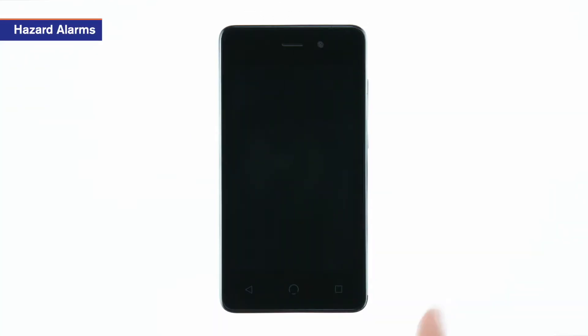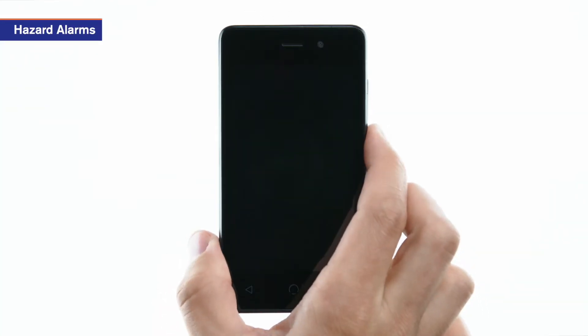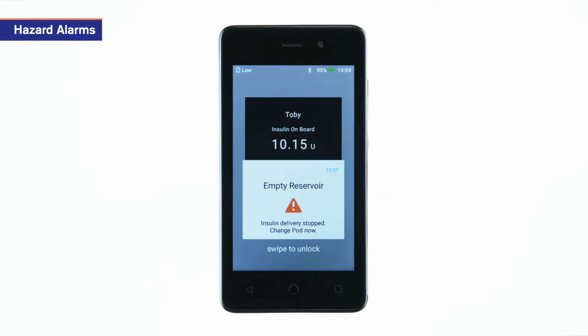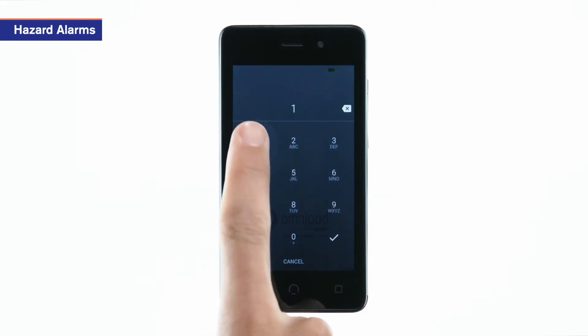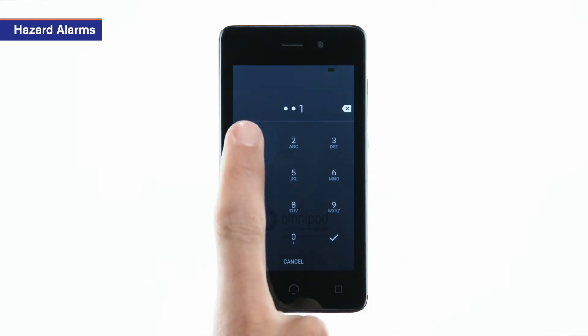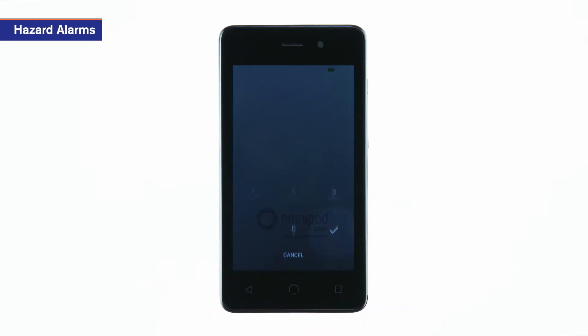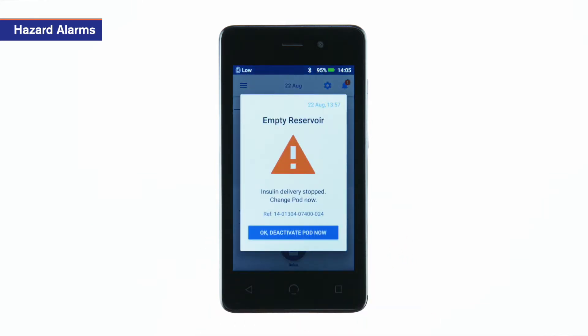To resolve a hazard alarm, wake the PDM and read the lock screen message. After entering your passcode, read the on-screen message, then tap OK on the PDM to silence the alarm.